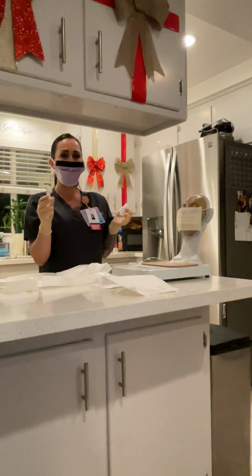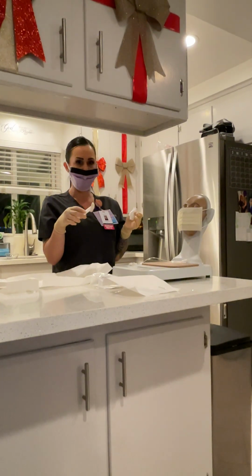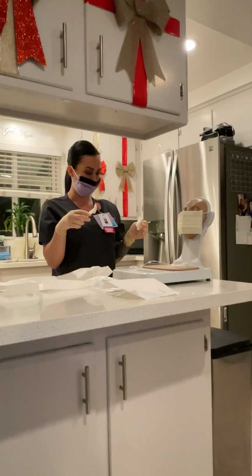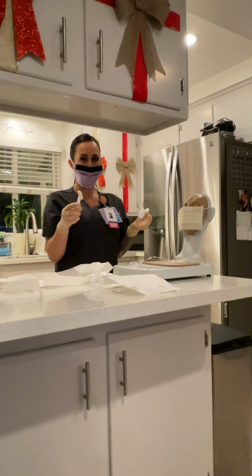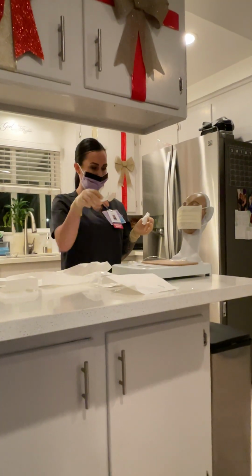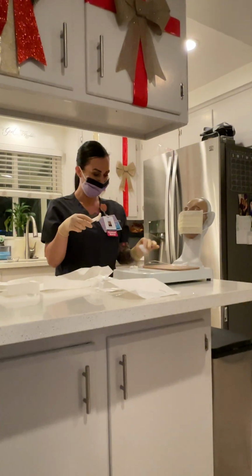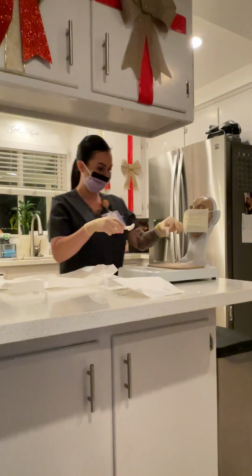Also, when you use chlorhexidine, you want to use friction in a back and forth motion for at least 30 seconds. If we were to use alcohol, we'd want to do that in a circular motion from the inside out. But since we're not, we're going to be doing it in a kind of square motion for 30 seconds with our chlorhexidine. All right. So I'm going to grab my catheter this time and I'm going to clean.